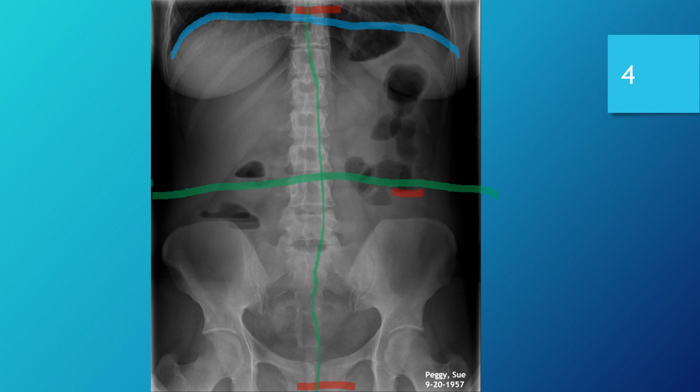And just as a visual guess here, I'm going to say that is definitely about 2 inches there. And so, yes, as far as positioning, this image was positioned very well.